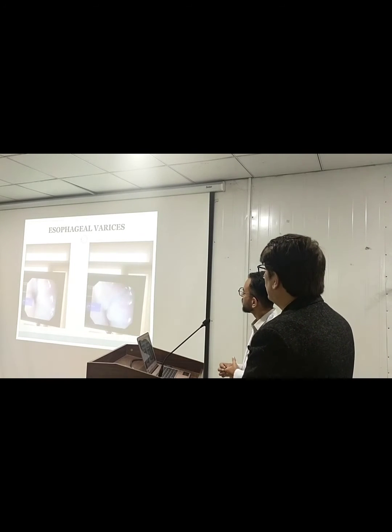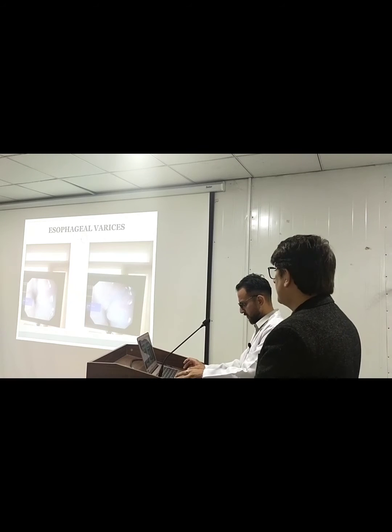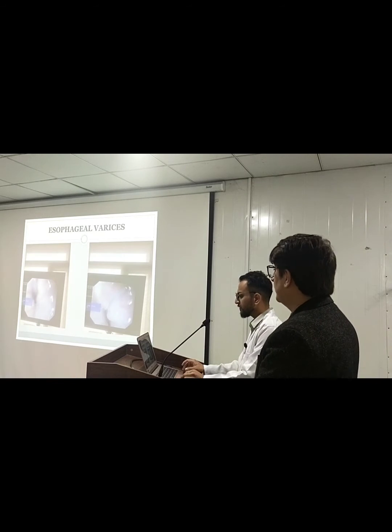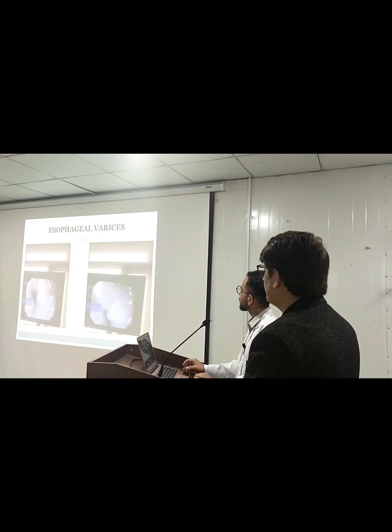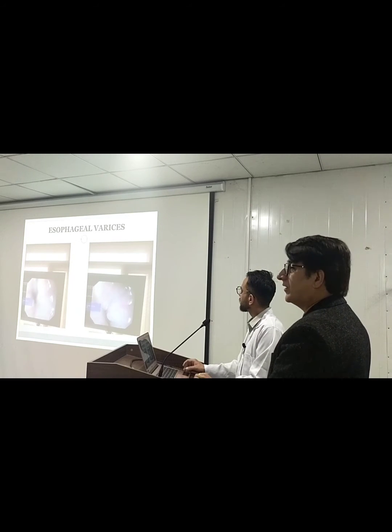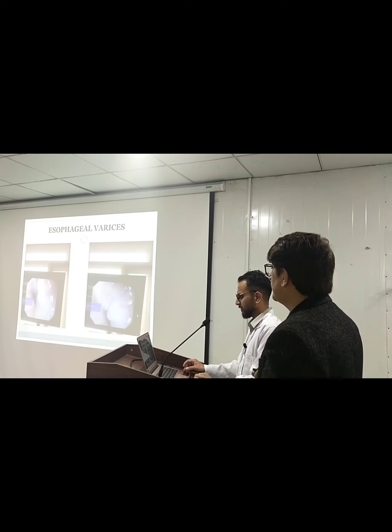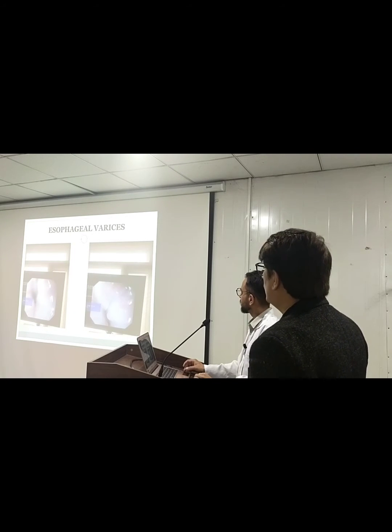Esophageal varices. So we have very few patients with decompensated chronic liver disease who report to us, but nowadays the number has increased. These are patients with decompensated chronic liver disease secondary to viral infections and some other causes, and we had a number of patients with non-cirrhotic portal hypertension and some other unknown etiologies. So this was our follow-up patient, whom we had previously done EVBL.